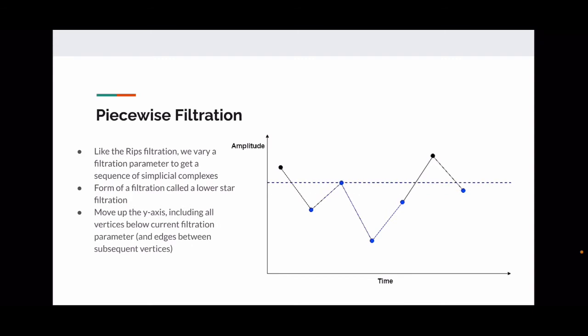So pretty easy when you're coding in R. Yeah. So this is what creates the barcode. It's a little more complicated than that. You have a filtration and a sequence of simplicial complexes, and then the barcode tells you how the connectivity changes as you go through those simplicial complexes in order.